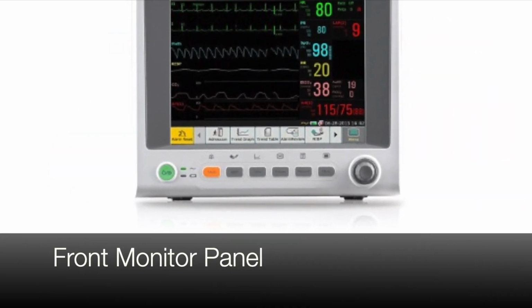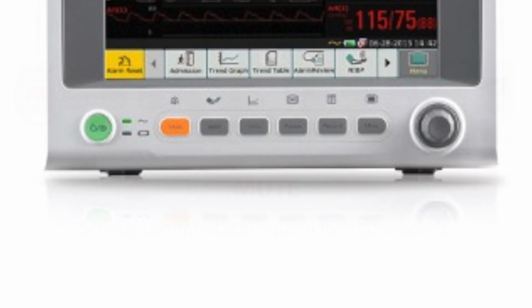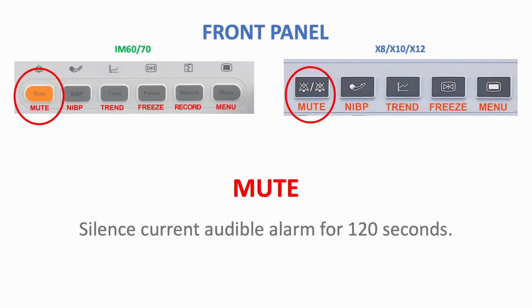Front monitor panel. The hard menu buttons on the front panel are indicated by icons and/or words. The first button to the right of power is mute. By default, mute will silence the current alarm for 120 seconds. As an example, silencing a heart rate alarm will not prevent an SpO2 alarm from being triggered. The mute button would need to be pushed again in order to silence the secondary alarm.